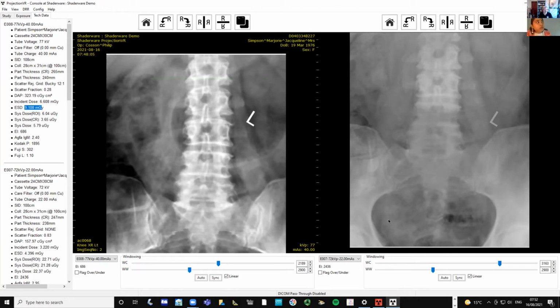What about video card? Does the computer need a video card? No, the latest Intel chips, from 2011 onwards, will run this without needing a graphics card. They'll run it on the Intel graphics. Obviously, if you do use a graphics card, then you get a little bit quicker, but it's not really noticeable. Our labs just use any computer on campus and it will run.